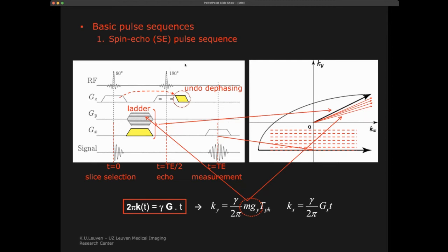But the main thing that you have to keep in mind is that we use a combination of flipping pulses, first flipping in order to get it in the XY plane where we're measuring, then gradients to either select planes or select positions, and then do encodings in order to make sure that we can measure and that we know where we are measuring, and then potentially use total flip 180-degree pulses to compensate for unwanted effects of non-ideal magnetic fields, potentially also using gradients to compensate for previous gradients with opposite gradients, and then in the end do the measurements.